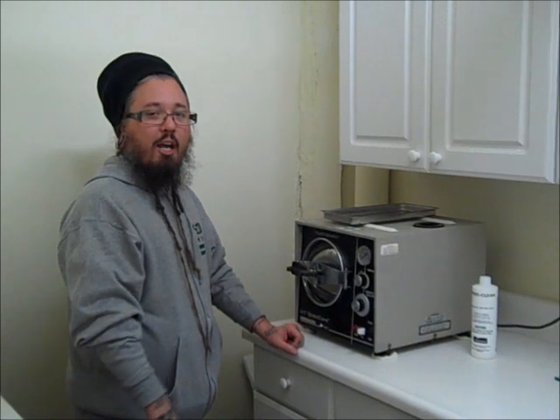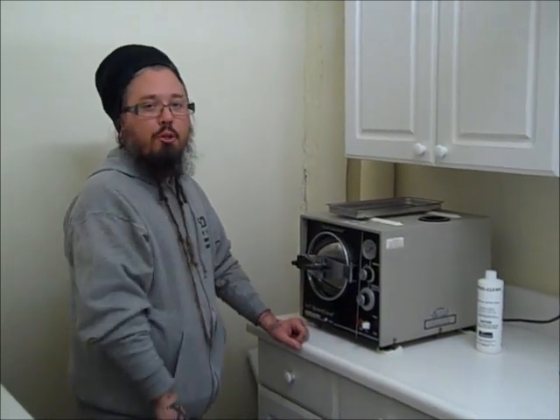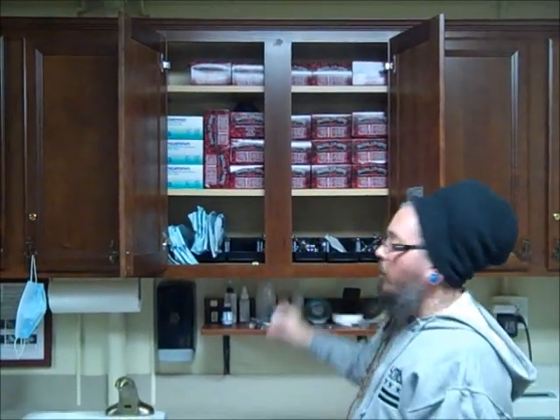This is my Midmark M7. This is also a fast-acting autoclave. This is where all the bulk items get processed after being decontaminated, which makes them safe to run in the Statum up front. Once tools and other implements come from the sterilization room in the back, they either get bagged and re-autoclaved for storage, or they get stored loose before being run through the Statum that we looked at first.